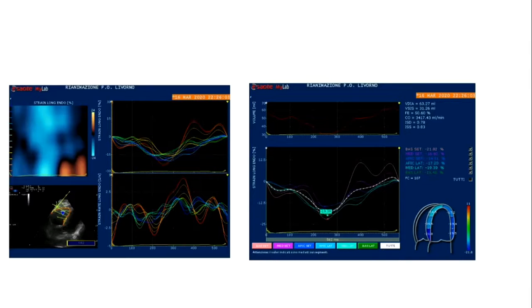Okay, when we gave the levosimendan, if you do the strain of the right heart function, the strain remains low. It seems that the right heart function recovered completely, but the strain remained low. And after 1 week, we had again, in the next slide, an enlargement of, please, the next slide.